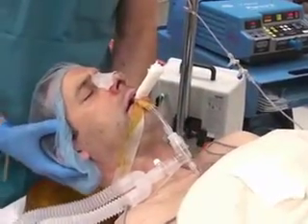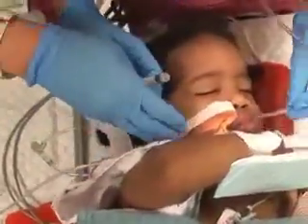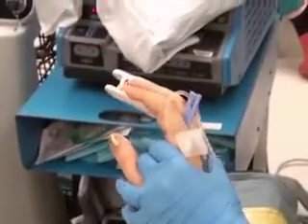Therefore, it is vital to protect the position of the endotracheal tube to keep the patient from accidentally self-extubating, which could cause hypoxemia. In addition, the patient's fingernails or objects such as the pulse oximeter could cause abrasions to his or her corneas if the arms and hands are not secured.